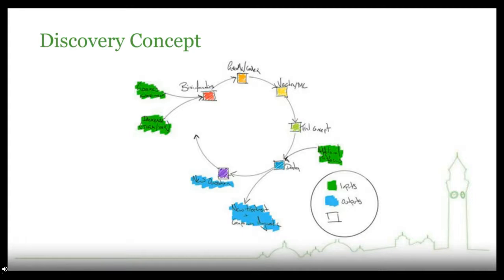But effectively, the idea of this facility was to provide a set of complementary platforms that vary in throughput and resolution and complexity that can form a pipeline for discovery and validation of discoveries, depending on what the input question is. You can come into this at different points. This was the workflow we envisaged at the time, but I can't really imagine sat in a pub so casually at the moment. It's very strange.